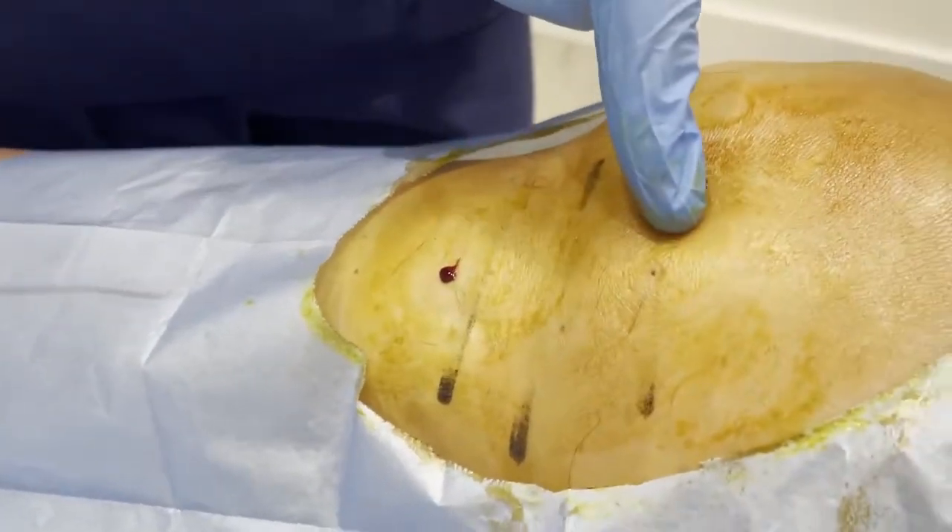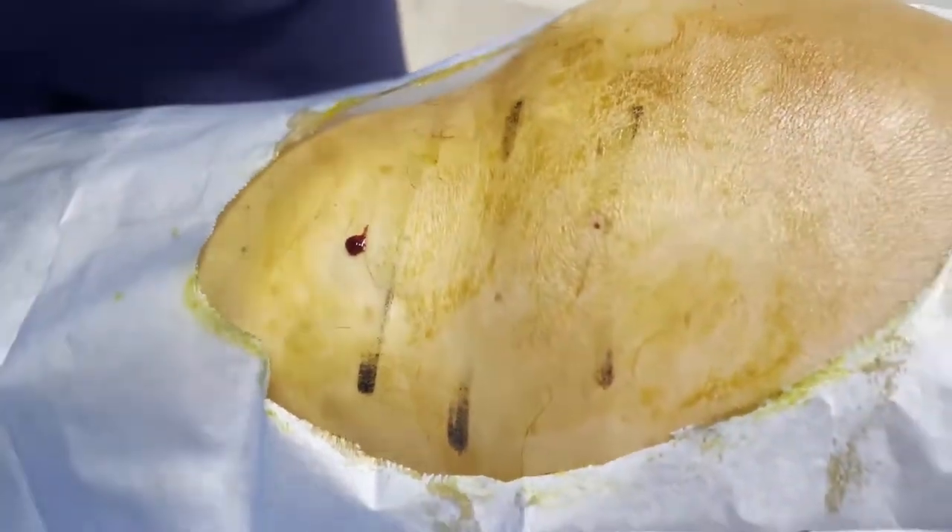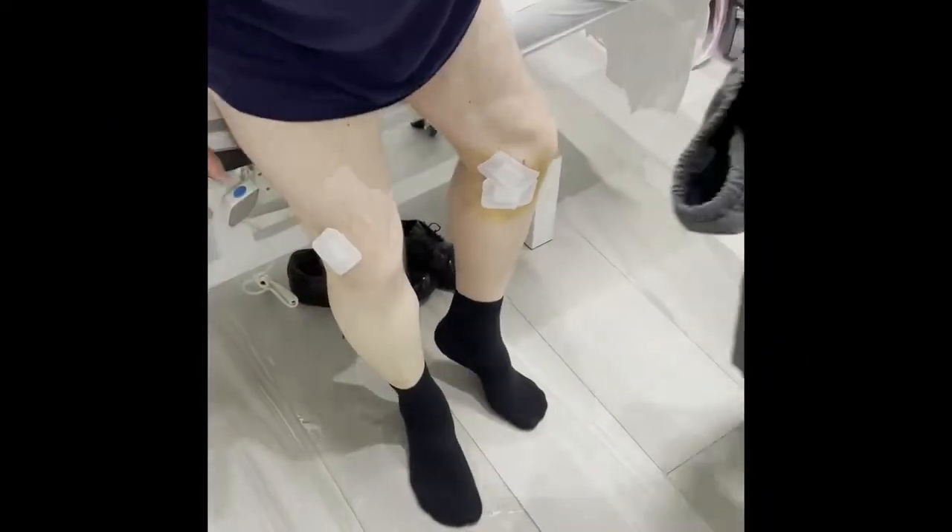In this way, the procedure is finished and the patient can immediately stand up from the operating table and start walking without any problem.